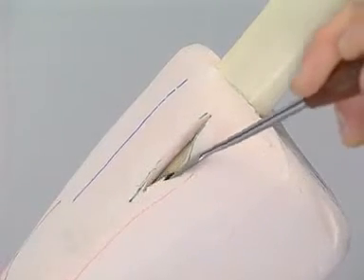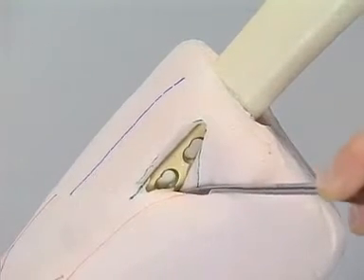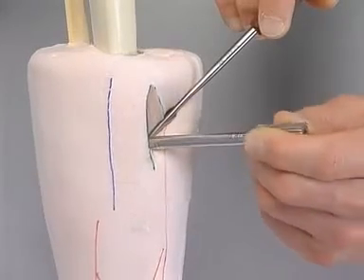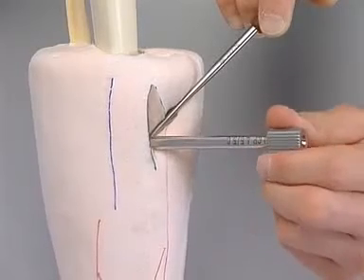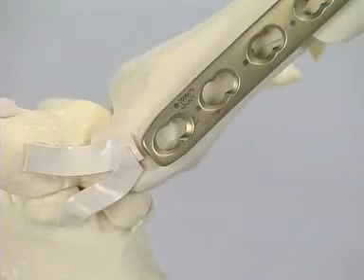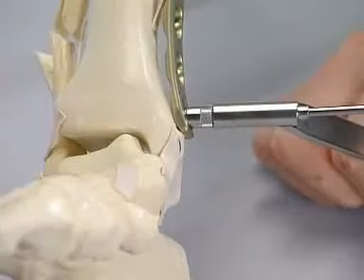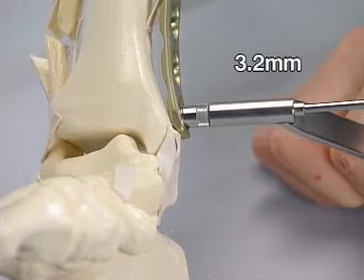The proximal end of the plate is aligned onto the middle section of the shaft, and a second threaded LCP drill guide is screwed into the second hole from the top. The planned point of entry of the 6.5 mm cancellous bone screw is 1 cm proximal to the ankle. It is drilled with the 3.2 mm drill bit, parallel to the K-wire inserted into the joint.